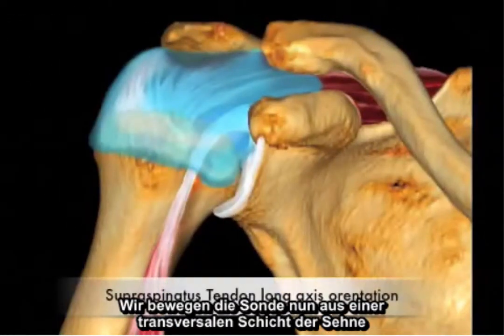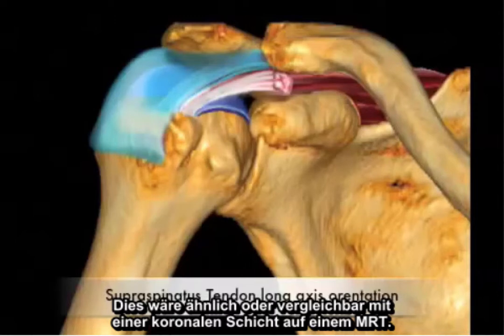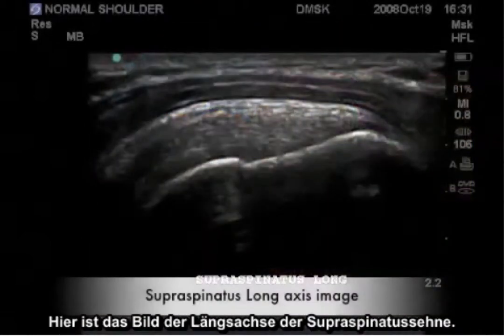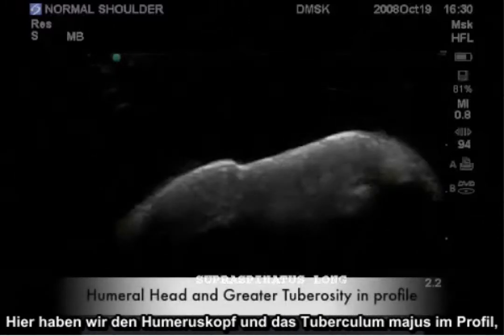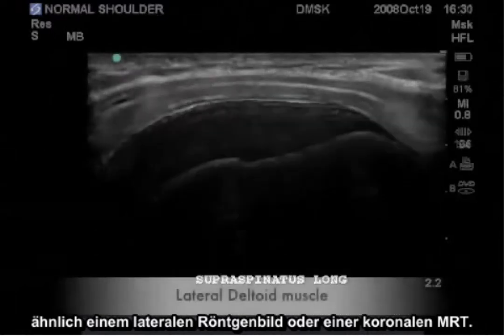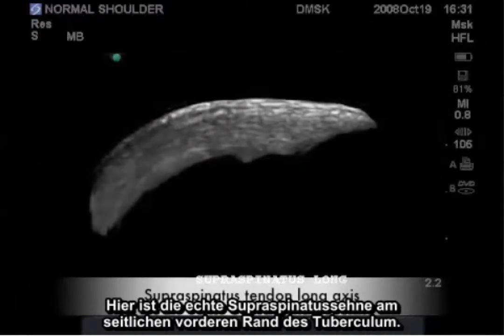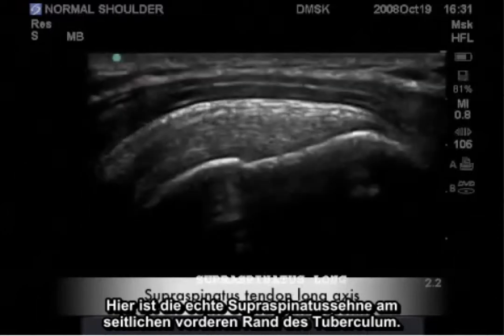We now turn the probe from a transverse slice of the tendon to a longitudinal slice of the tendon, which would be similar or comparative to a coronal slice on an MRI. Here is the representative long axis image of the supraspinatus tendon. Here we have the humeral head and greater tuberosity in profile, similar to a lateral radiograph or coronal MRI, along with the lateral deltoid muscle in long axis. Here is the true supraspinatus tendon at its lateral to anterior margin of the greater tuberosity.